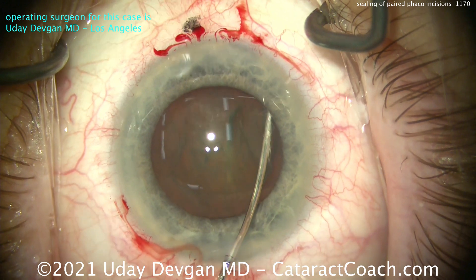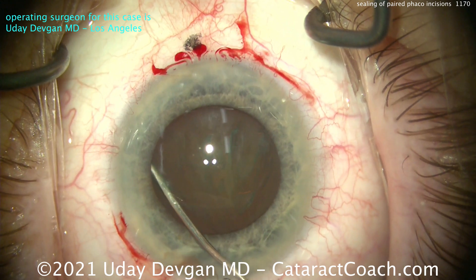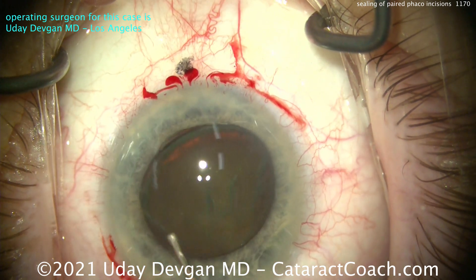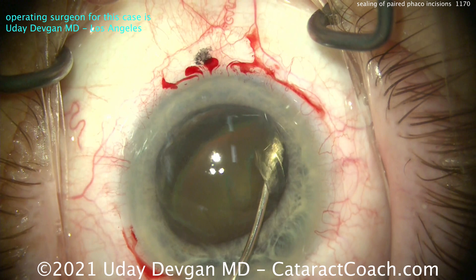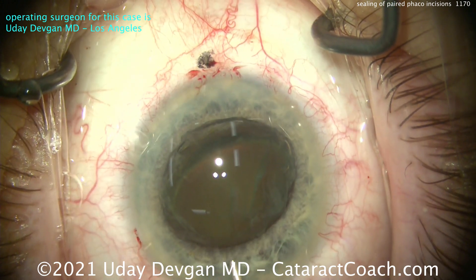Its sole purpose was treatment of pre-existing corneal astigmatism. So do you need to seal it up, or will it seal on its own? Both incisions have identical architecture, made with the identical instrument — that diamond keratome.